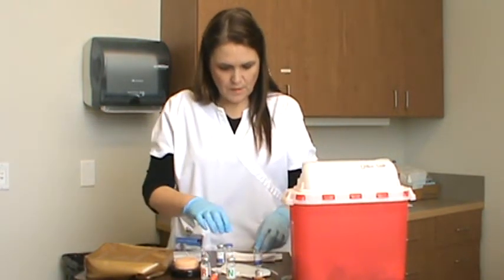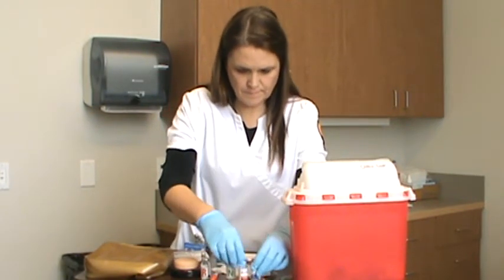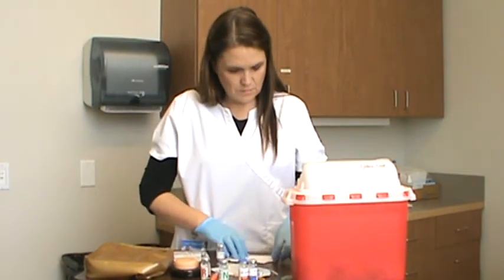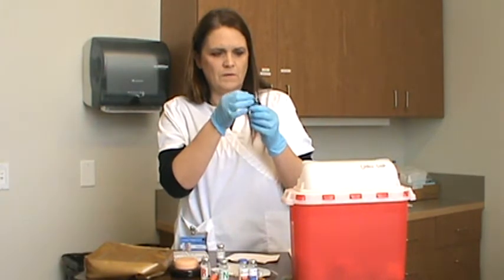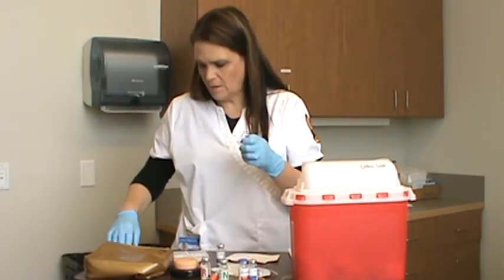Okay, so I'll pull up my morphine, and then I'll show how you can get that. You want to make sure that all the liquid is off of this and down in here. Okay.